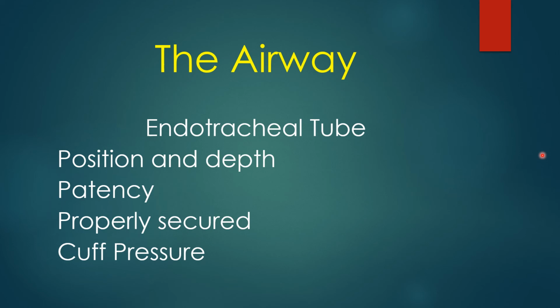And the depth of the tube. You can look and see numbers on the tube in centimeters, and you see it says 23 at the teeth. Well, that should be documented. So if you have a problem with the ET tube and you think, well, did it come out or did it go down too far? And you know, because everybody's been documenting that it's 23 at the teeth, that isn't the problem. But if you see it's 20 at the teeth and it's supposed to be 23, then you know that the tube has changed its position.